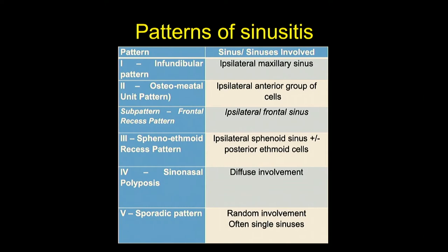A sub-pattern under Pattern 2 is the frontal recess pattern, which obstructs only the frontal sinus drainage pathway, so disease will be localized to the ipsilateral frontal sinus. Pattern 3 is the sphenoethmoidal recess pattern, involving the posterior group of sinuses — disease will be localized to the sphenoid sinus plus or minus the posterior ethmoidal air cells.